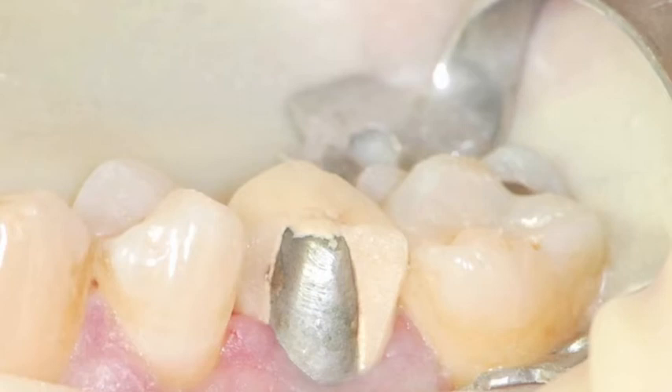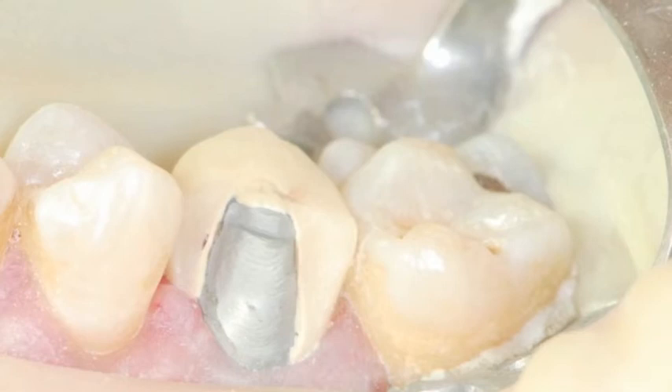Here is a clinical photo of the fractured crown. The labial porcelain is missing, and likely fractured from unsupported thin porcelain on the occlusal surface. I used a shouldered diamond burr to prep the labial surface. The occlusal part of the fracture was lowered, and the finish line extended in approximately to hide the finish line. Utilizing the Danville Microetcher 2A, I treated the surface with the SilJet powder. After treatment, the surface will appear dull and gray.